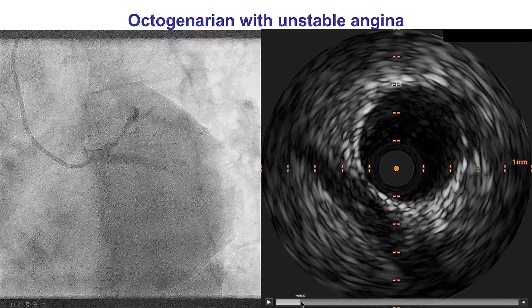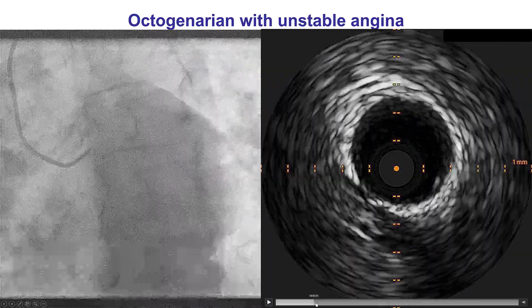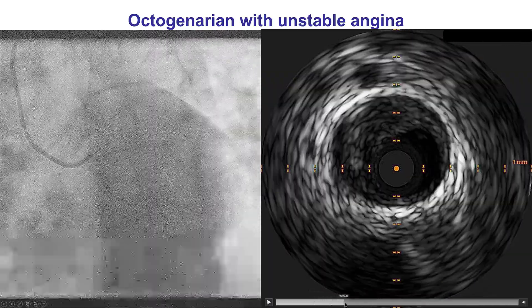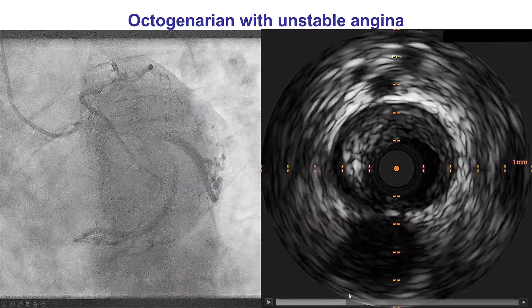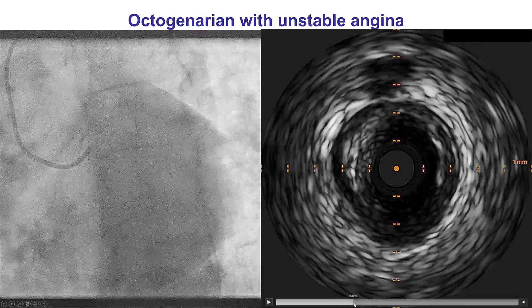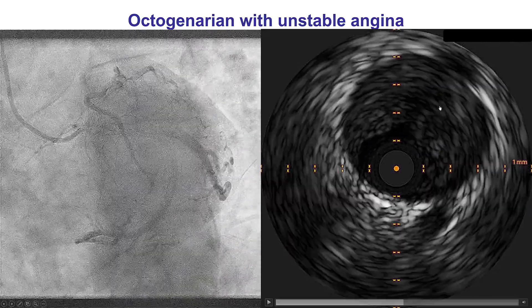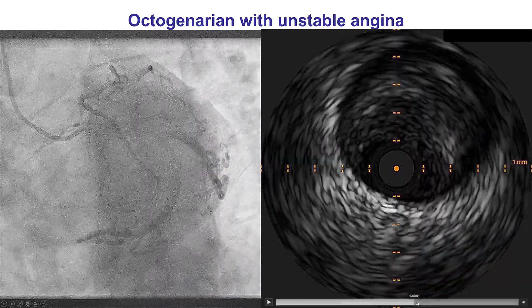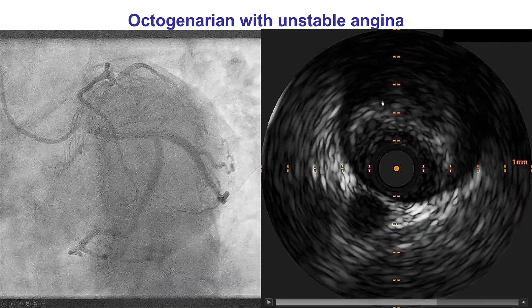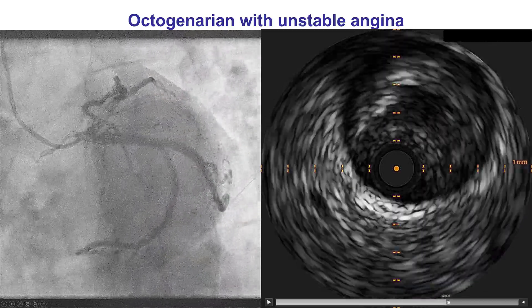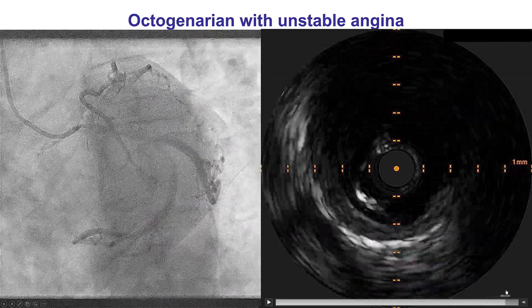We did intravascular ultrasound that demonstrated extensive plaque starting in the mid-LAD. As we come back more towards the proximal LAD, there is a large size branch — this is the origin of the diagonal branch, and it doesn't seem to have significant disease. Moving further back towards the left main, there is extensive plaque burden with no calcification, and some ultrasound attenuation suggesting a high lipid burden plaque. The left main is fairly large without any significant disease.